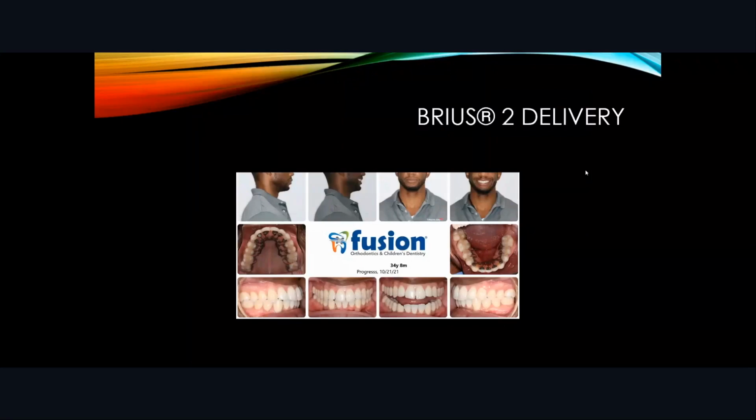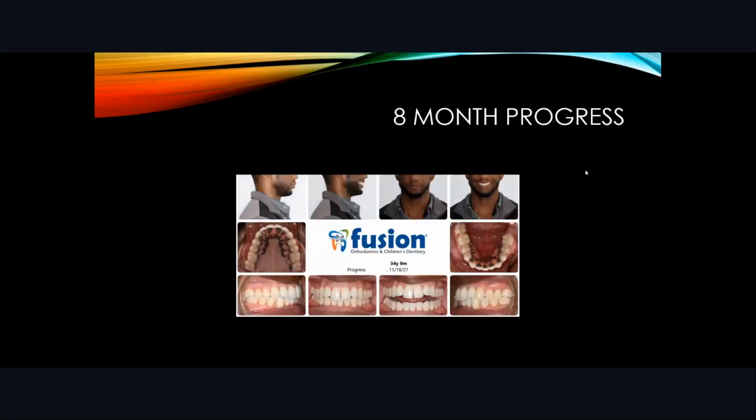If you still have some way to go, you have to decide to do it with aligners, which is going to be more efficient than regular aligners, or you've got to request a second Brius. With my extraction cases, usually I need a second Brius to do all the detailing. In this case also, that's what we did. So the space on the bottom at this point is almost closed.